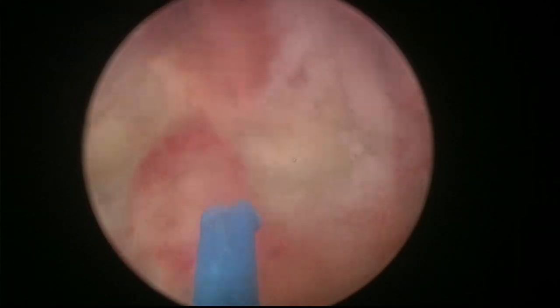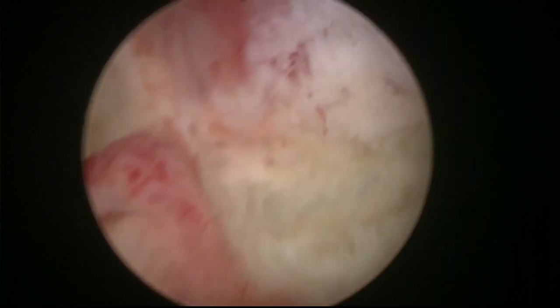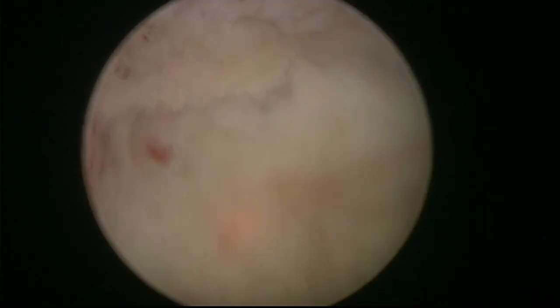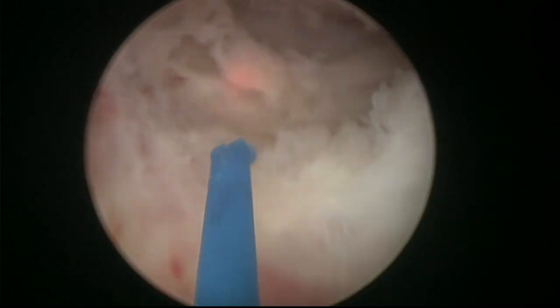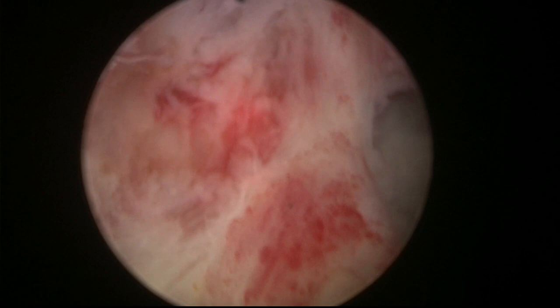The plane is very easy to find near the verum montanum, so you can put your scope here and push — do a little bit of mechanical dissection, push a little bit to the side until the plane is more or less revealed. This is the advantage of the Wolf instrument, which allows you to do this. When I put the instrument against the tissue, I can still see the tissue — with some other instruments, when the tip of the scope contacts the tissue, you cannot see it.